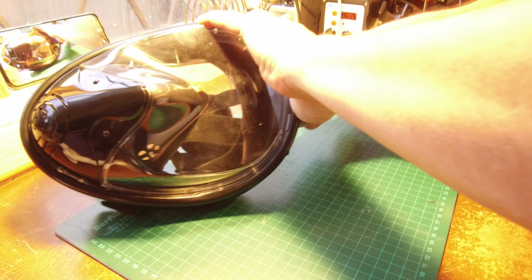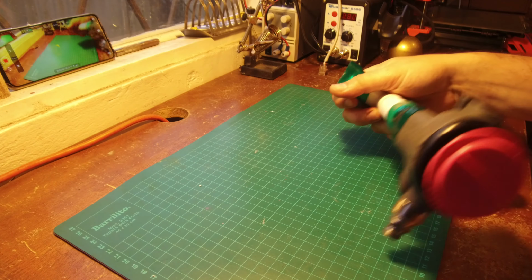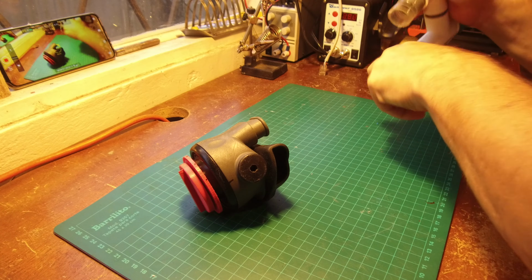There are some more elegant solutions. Let me show you one. If you want this and you have a 3D printer, it might come in handy.